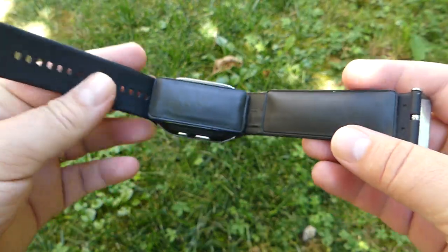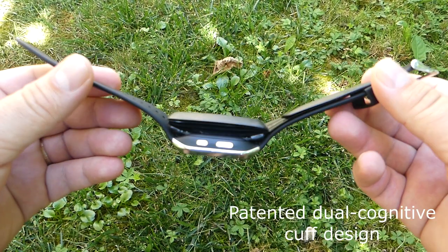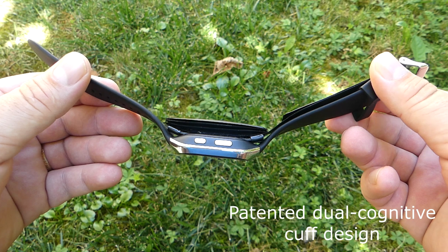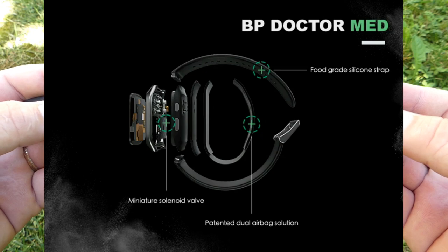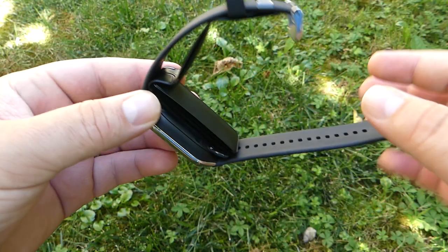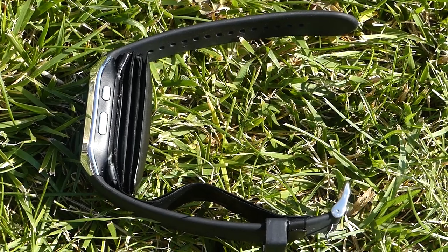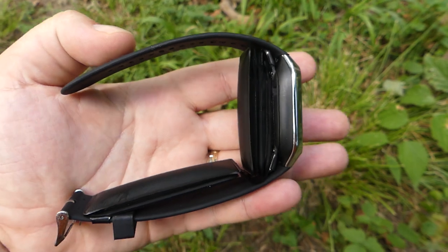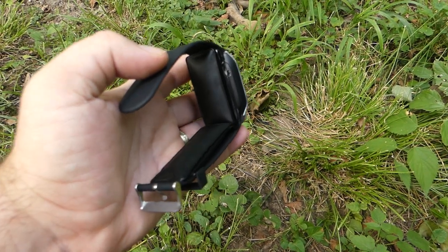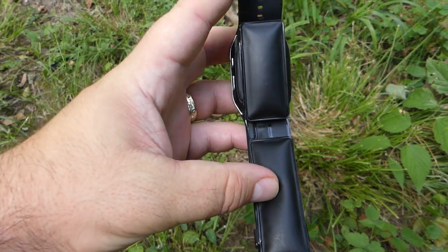BP Dr. Med is a globally recognized medical grade wearable blood pressure smartwatch. It features a patented dual cognitive cuff design that enables 24/7 monitoring of blood pressure levels through the traditional oscillometric blood pressure measurement method. In addition to hypertension monitoring, BP Dr. Med tracks your daily activities and sleep time, providing comprehensive health data insights.